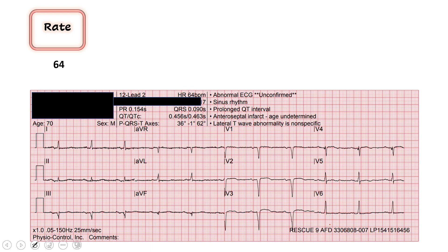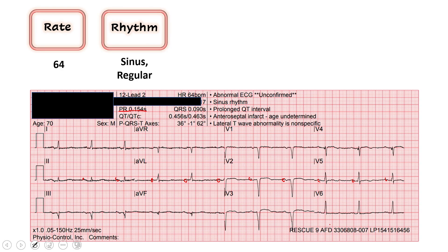Next we evaluate our rhythm. The two questions we always ask: is there a P wave before every QRS, and is this a regular rhythm? I can see P waves that are pretty regular throughout. Our PR interval is less than 200, so no first degree AV block. This is a sinus rhythm. It looks regular — no big gaps, no short intervals. I'll call this a regular sinus rhythm.